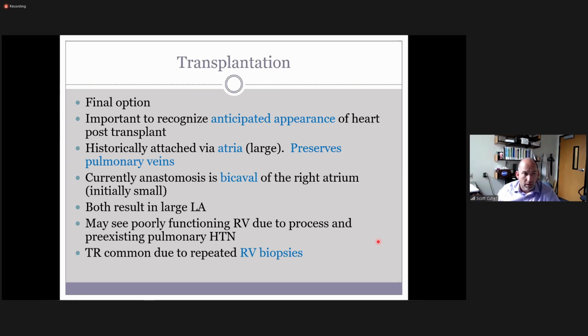So the point is, when they do a procedure, you want to know what was done, because when you go to do the exam, you need to prove where those attachments are done. And we're looking for places where maybe it's leaked out or there's problems occurring because of it. So often a lot of the failures come in the area where it's actually sewn together, okay? Because of inflammation, because of rejection, there could be a whole bunch of different issues with that.